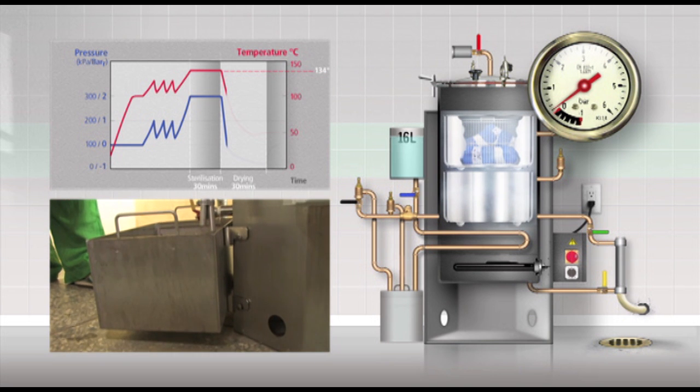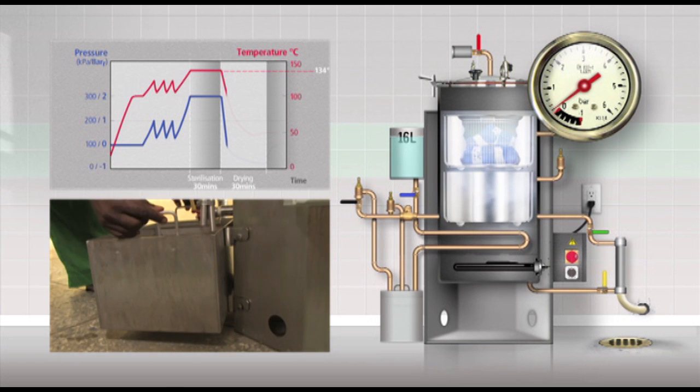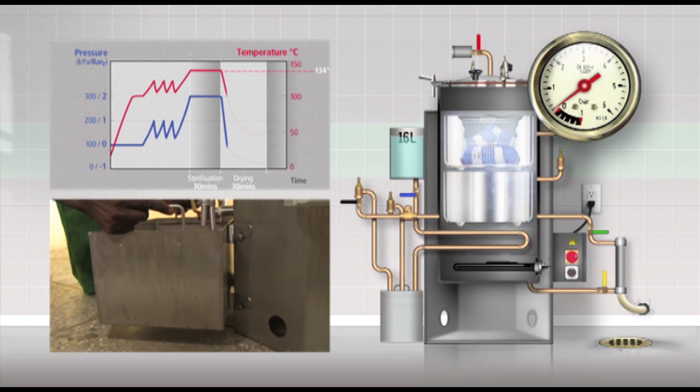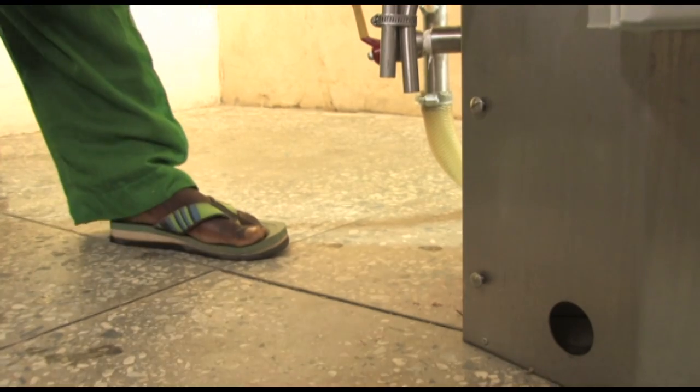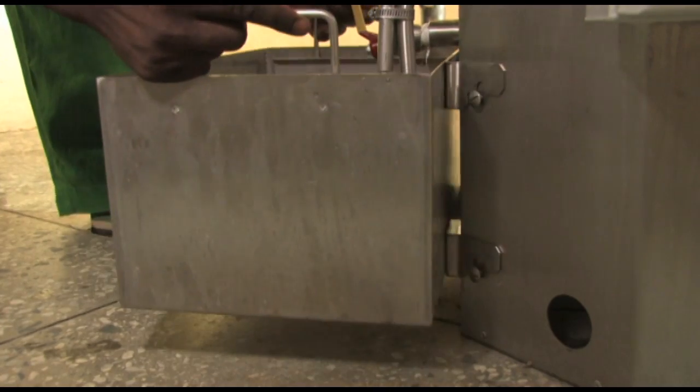If you have been using the autoclave already, the lower exterior water tank may be full. If the water is cold, you can reuse that water for filling the upper tank. Remember to replace the lower water tank.